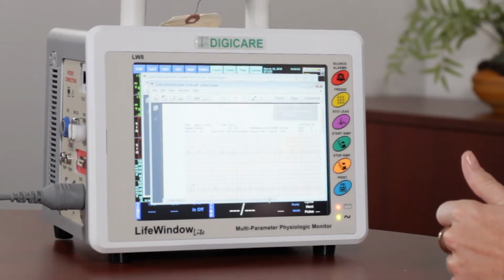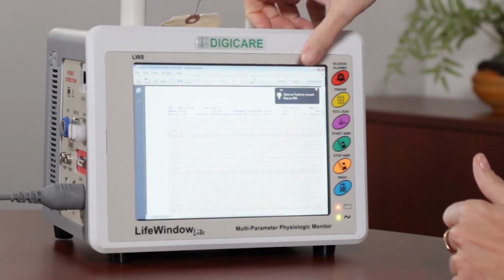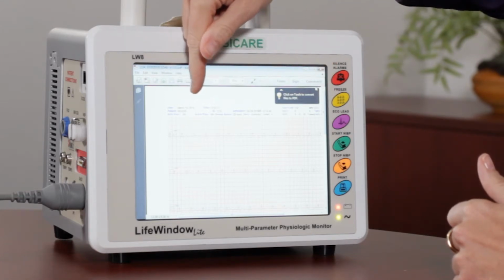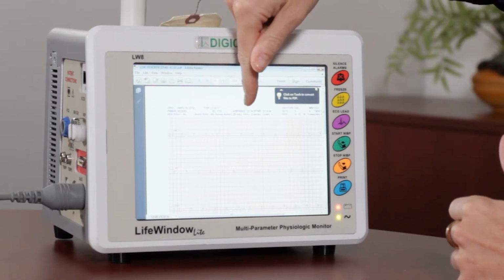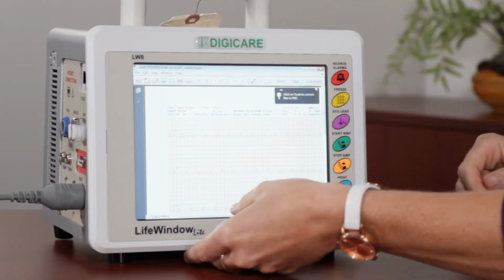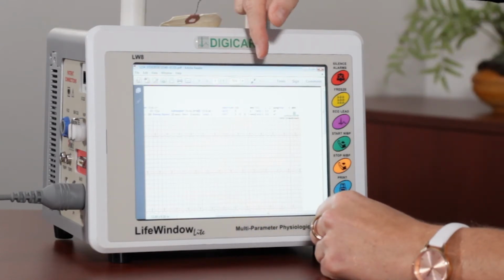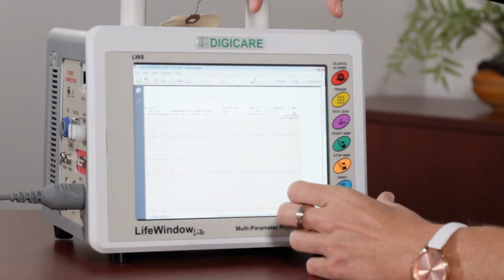and it's going to automatically populate your ECG to PDF. You don't have to tell it to do that. So here on your screen is the PDF of the ECG. You have the date, the patient's name. It goes over the settings for your ECG, the filters, the sweep speed that you've adjusted it to, the gain, what lead you've printed. And then if you scroll all the way to your right, this is a really cool feature of this PDF because it actually gives you a picture of what was going on with that patient in that 30 seconds that you took this PDF.